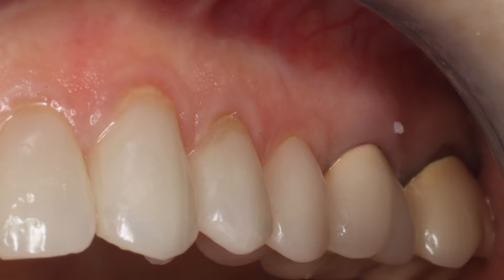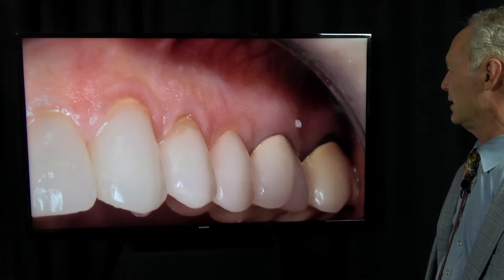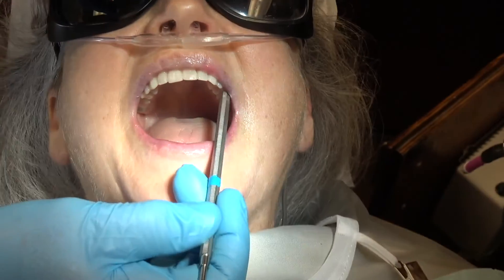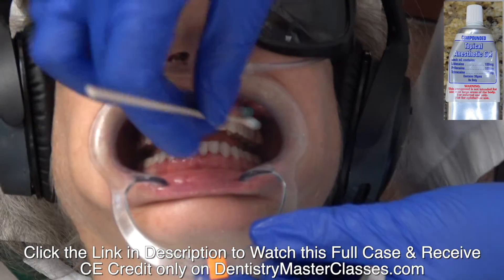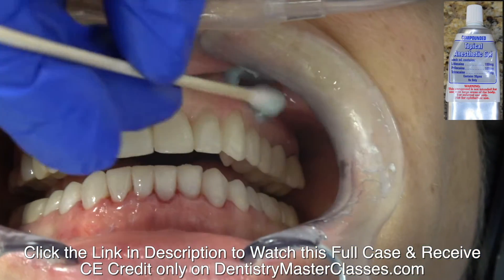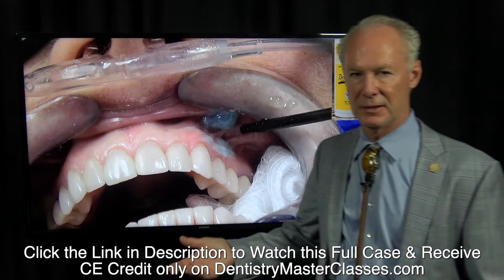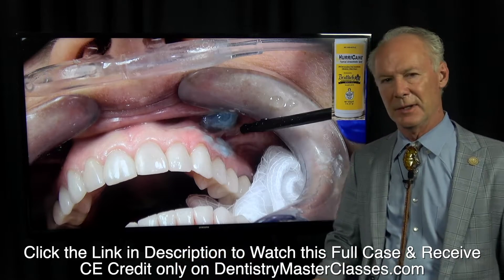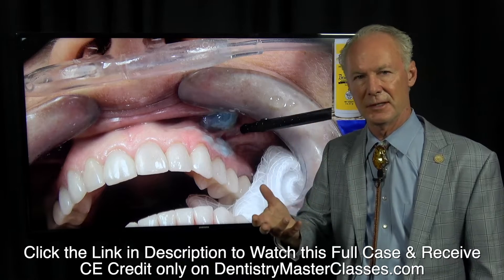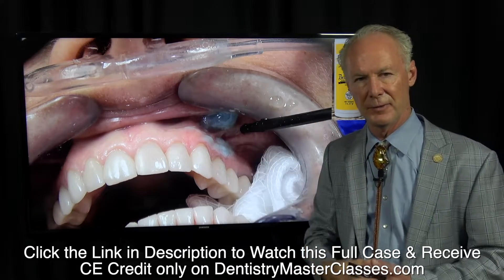So this is the tooth that's going to receive the apicoectomy, because she's having pain in that tooth. Testing it, she confirmed that's the one — she hadn't been able to bite on it in years. Some people would say redo the endodontics; I'm not against that, but an apicoectomy just knocks it out. If you cut the tip of the tooth off — if you understand surgery — cut the tip of the tooth off and retrofill, case done.